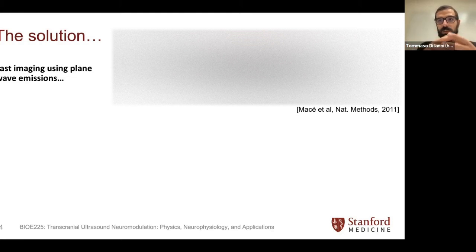The receive part will be similar in the sense that we're still beamforming in the points where we have some signal, right? But because we are losing the transmit focus, that we would have physically when we transmit a focused beam, where the ultrasound physically focuses in one point and then diverges, here we don't have that in transmit anymore. So we kind of recreate it virtually, in a way, by combining different angles. Does it make sense? Yeah.